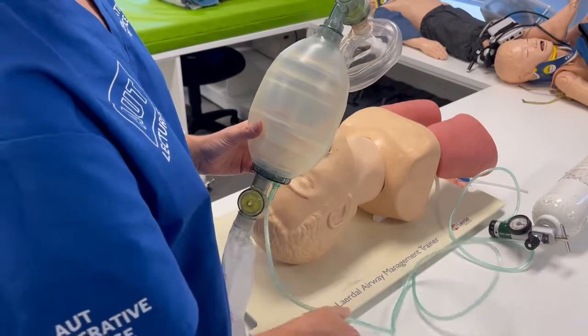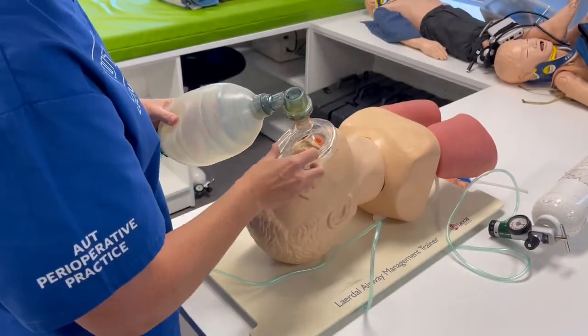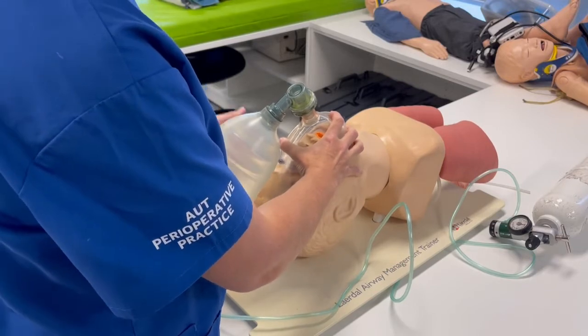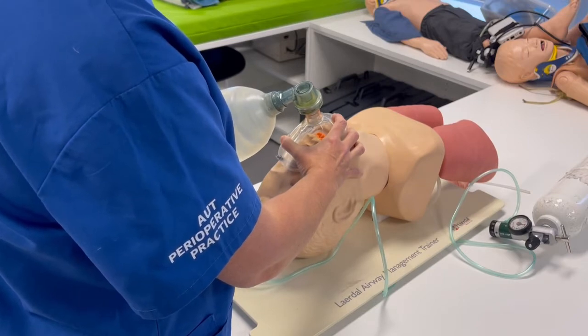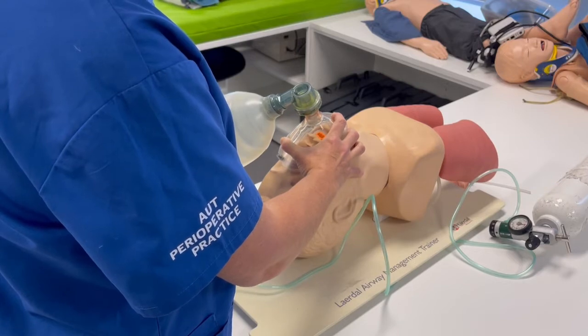Your resuscitation device should be attached to a source of oxygen. Place the mask on the nose and seal it on the bottom of the chin. Make sure you have a nice head tilt chin lift, and squeeze gently enough to make the chest rise every six to ten seconds.